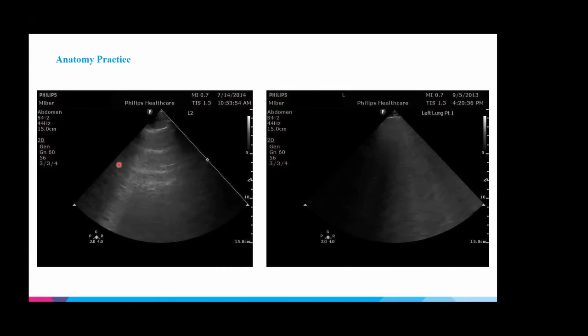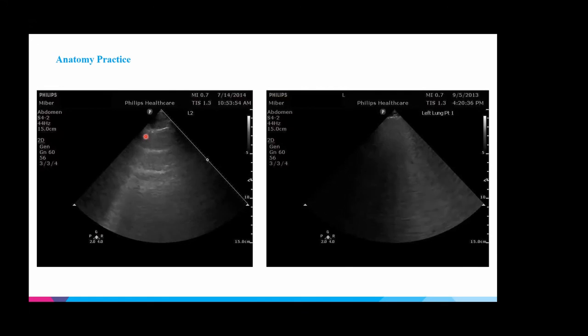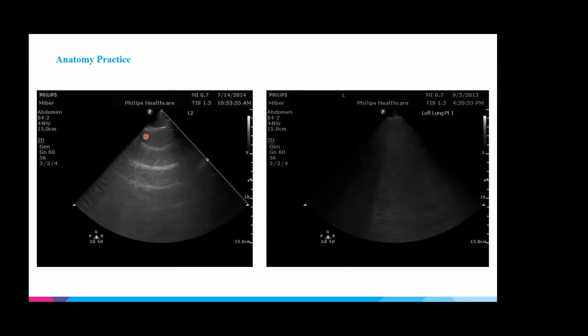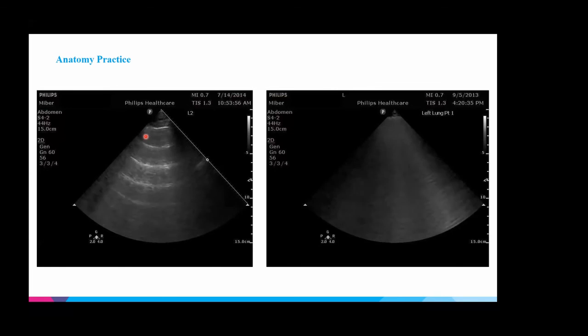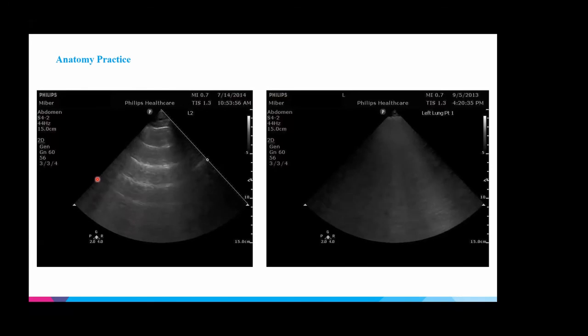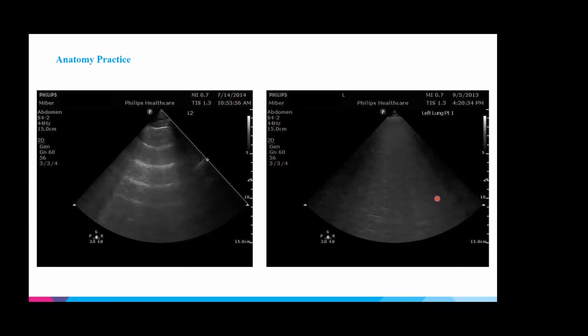And then when we're characterizing is this a B line pattern or an A line pattern, if a patient's lying in bed all day, they might have a small amount of atelectasis in their lung base, so it's okay to have 1 or 2 B lines. But once we get past 3, that's probably abnormal. So I would say this is abnormal. This is probably B-line predominant, even though you can still make out a lot of the A lines. What about here?